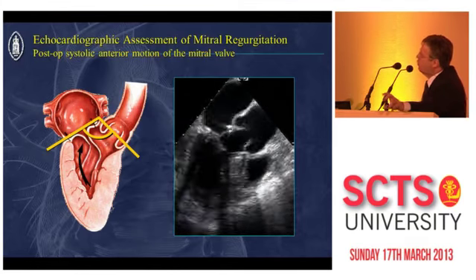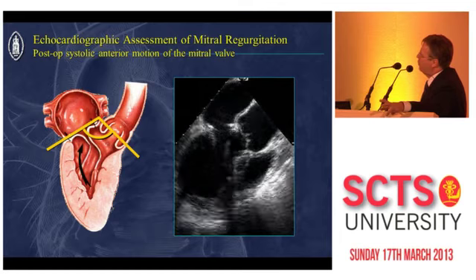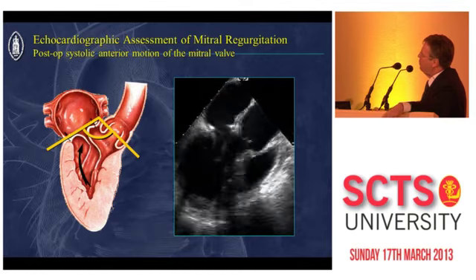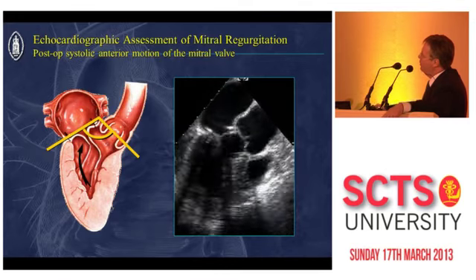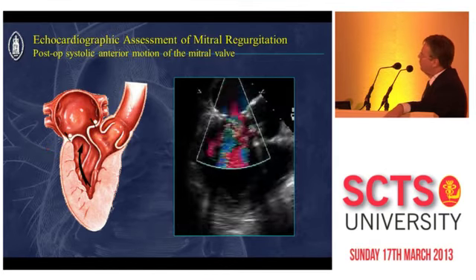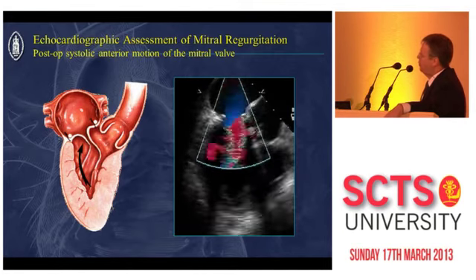So we have three of the most important factors that lead to SAM postoperatively: a small ring, a tall posterior leaflet, and a narrow mitral aortic angle. And of course this leads to a gradient in the left ventricle and to mitral regurgitation.